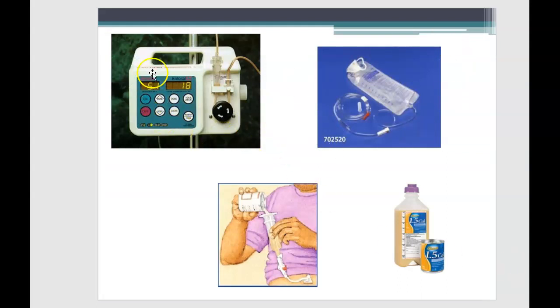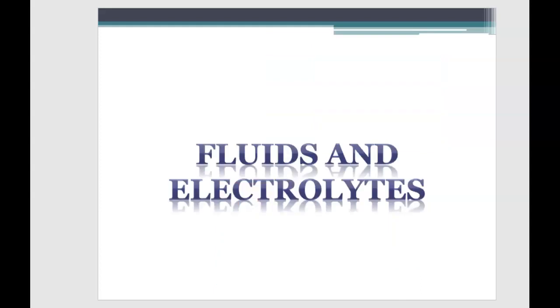This just shows you what the machine looks like. They have more higher tech machines. This is for the patient that will deliver not medication. Oh, well, you can deliver medication, but this particular device is to deliver the feeding through the tube here to the patient, or the patient can have it by gravity, where they will pour it in and hold it, and it goes in very slowly. Each one of these is either you can pour it in a bag that's attached to here, or you can pour it in the syringe, and they come in different calories. 1.5 is what we see here, but it depends on the dietitian and how many calories she wants the patient to have.